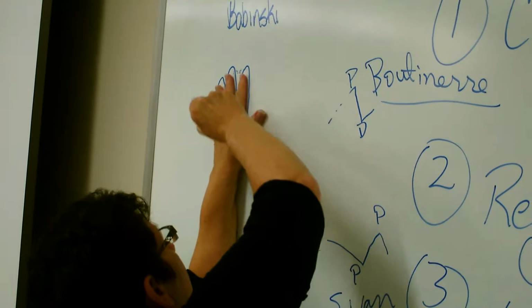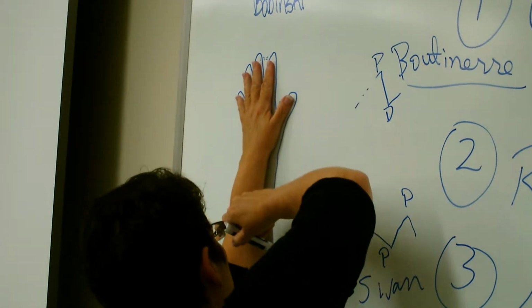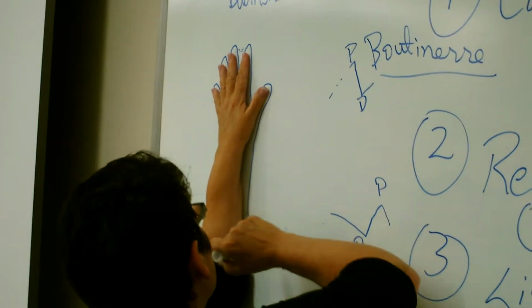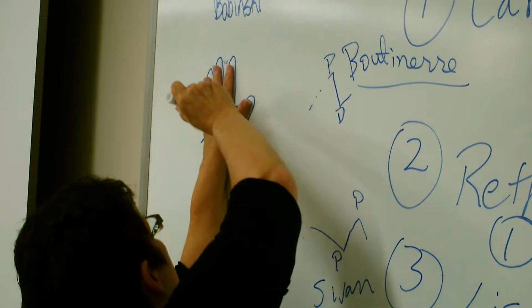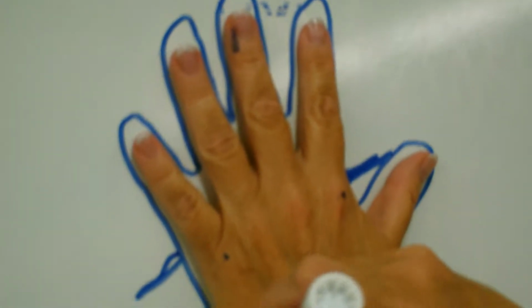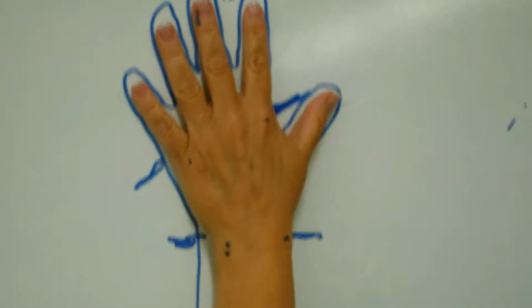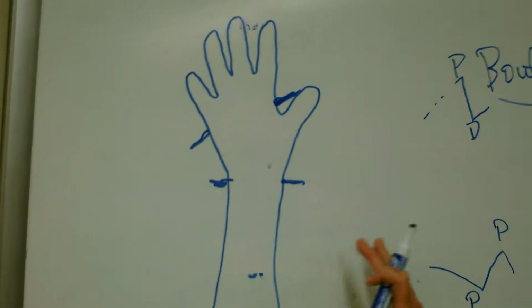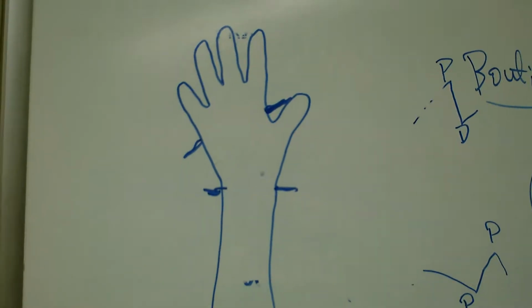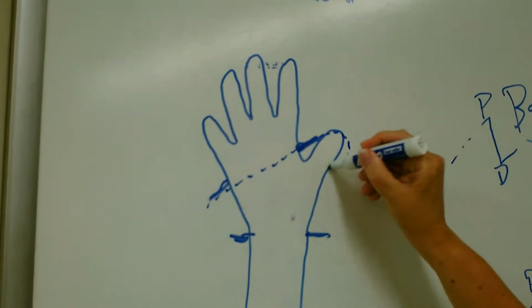So you trace the person's hand. Okay. And before they lift up, I always mark that the splint should go 2/3 up the forearm. I mark the distal palmar crease, which is sort of at the MP joints right here. You could come closer and take that, Michael. The little dots on my hand. I mark the ulnar styloid and the radial styloid. See it? You got it, Michael? Yes, ma'am. I got it. Then you lift it up. Stay here, because this is going to be the big finish. Okay? We're going to connect the dots. Okay? And so you connect the dots at the distal palmar crease.